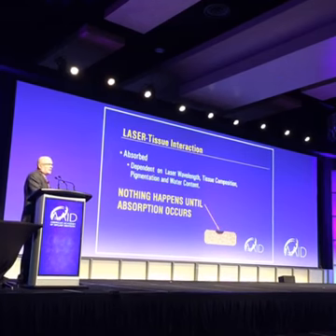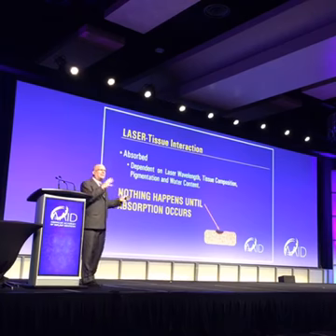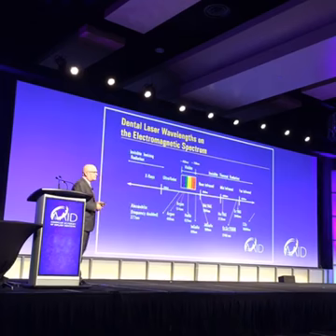That's dependent on the laser wavelength, the tissue composition, the pigmentation, and the water content. So if a laser company says, oh, our laser can do this, and it's not absorbed, it doesn't really make a difference. You can't change physics. So this is just the electromagnetic spectrum.